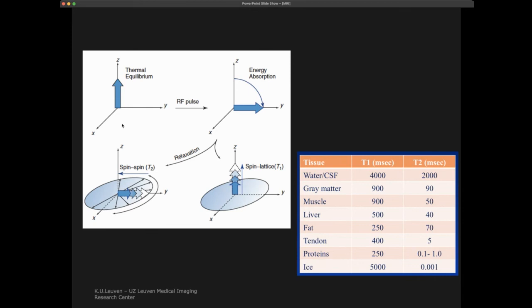And if we have total dephasing, of course, we have a reduction of the amplitude of the whole vector to zero. That's T2 relaxation. Happening in the XY plane, no energy loss, because we have a different rotation frequency, because every proton sees a slightly different magnetic field.